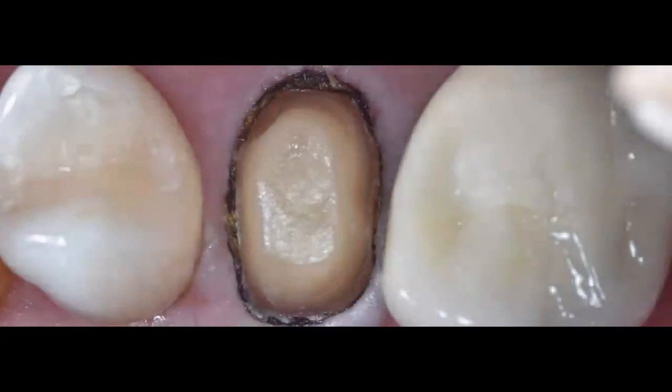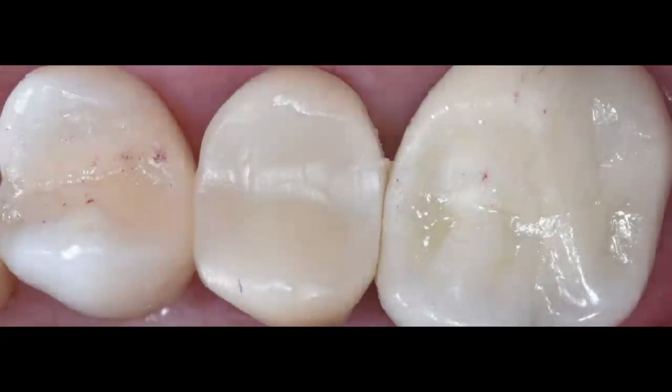So that's exactly the way that I explain it to my patients. So now I go ahead and I remove the rubber dam. I do a very fine chamfer around the preparation, making sure that everything is nice and round. Pack some cord, scan the preparation, send it to the lab. I put my temporary on, and this type of temporaries, I bond them.